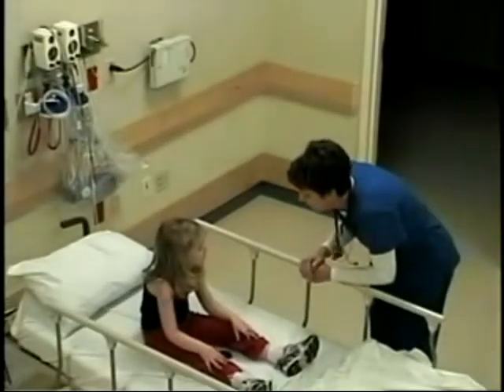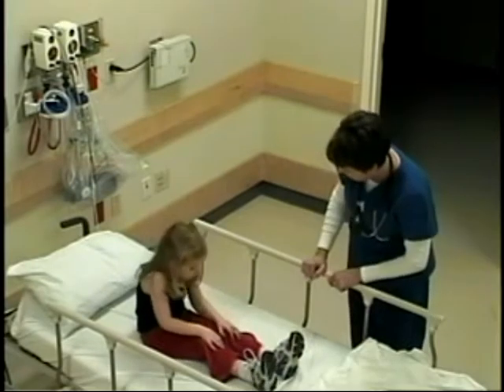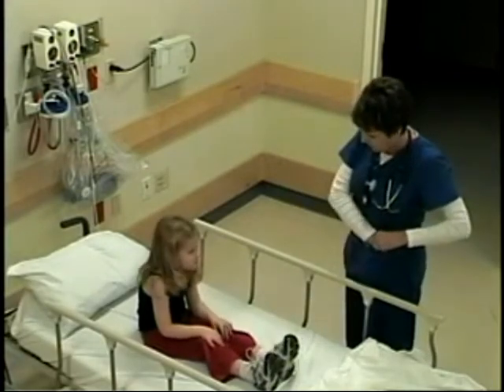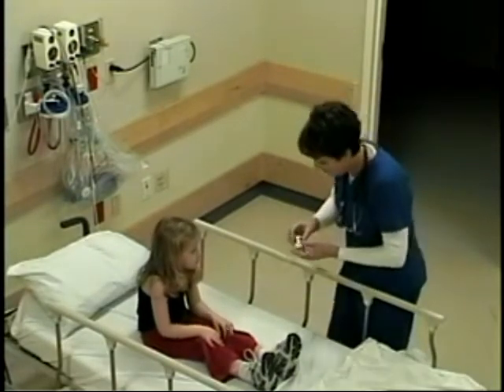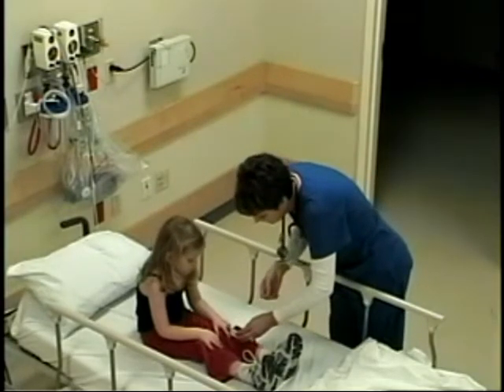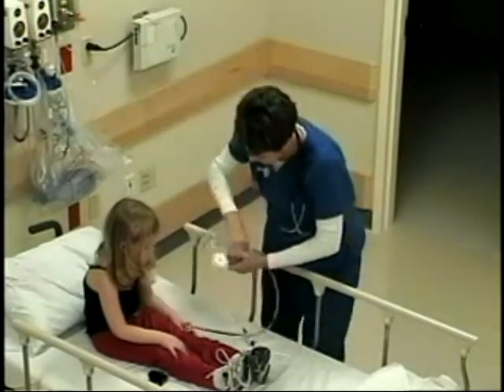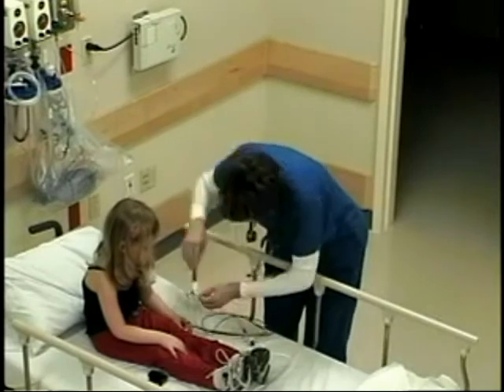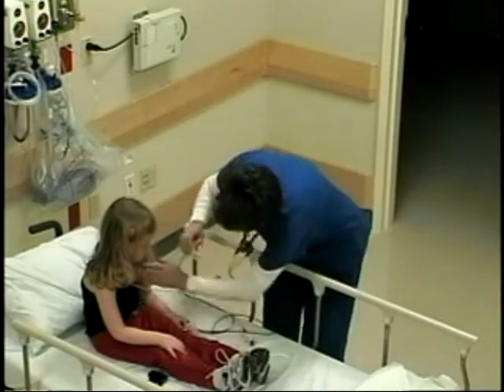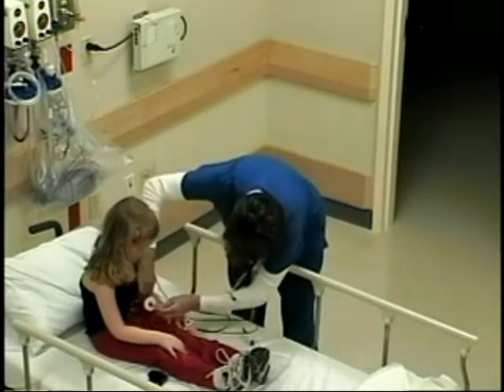Hi Maddie, my name's Tanya. I'm a nurse here in the emergency room and I'm going to be taking care of you today. Do you like Polly Pocket? Maddie, you look like you're working awfully hard to breathe. I have a little light here that I'm going to put on your finger — this is going to check your oxygen. So that's my little band-aid. And these are my stickers — there's three of them. I'm going to put one right up here, one right over here, and one goes on your belly.